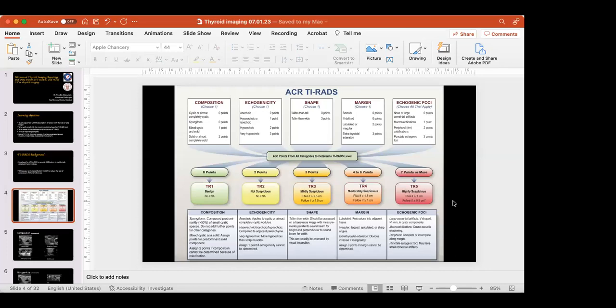I think the question is almost similar. Should we do an ultrasound guided FNA or only FNA? Okay. So they are asking, should we always do an ultrasound guided FNA, or would a simple FNA be fine if it is a palpable nodule? It's mostly recommended that in these tiny structures, you always do an ultrasound guided FNA, because you will target the nodule at its maximum peak. And anyway, you are going to get an ultrasound done for characterization of the nodule. So might as well in the same setting go ahead with FNA.